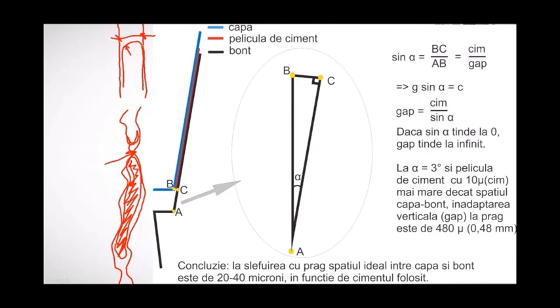So you see, this is the cement, and it's round there. Half of that circle is the thickness of one molecule. So you can imagine two molecules, one over the other, of cement. It's actually more than two molecules, but just imagine like that, and you can't squeeze it more. So that's the thickness of the cement. Okay, that's the minimum thickness of the cement.